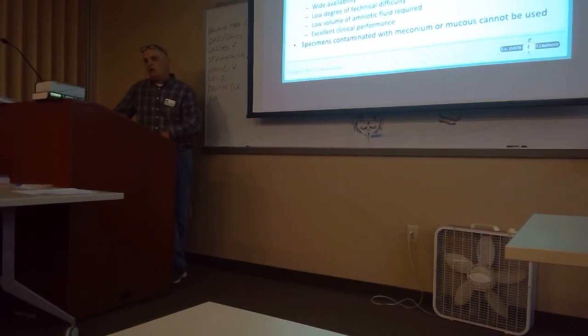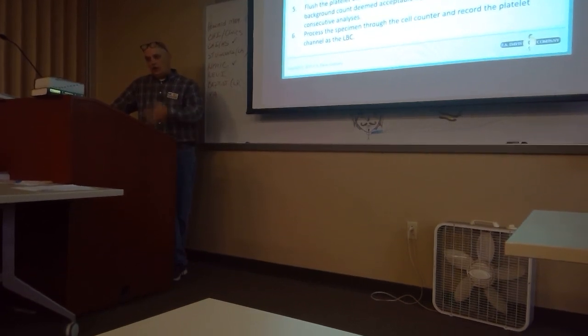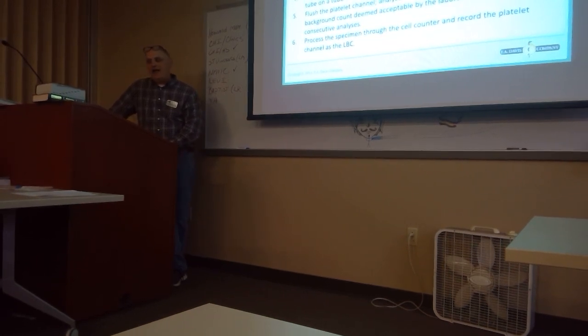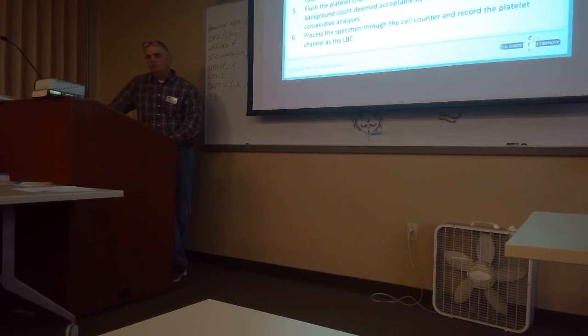So you can read about all of that, but basically that's what I want you to know about the lamellar body count. It goes on to tell you about running it through the analyzer and putting it on the rocker. I just want you to know that you can get a lamellar body count by running it through the platelet channel on a CBC analyzer.